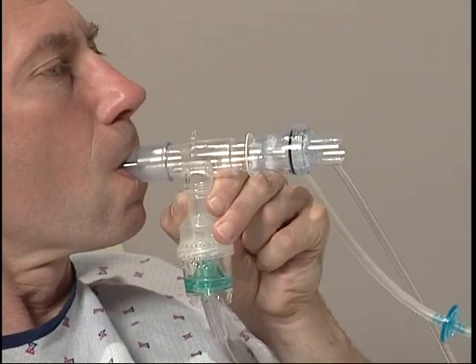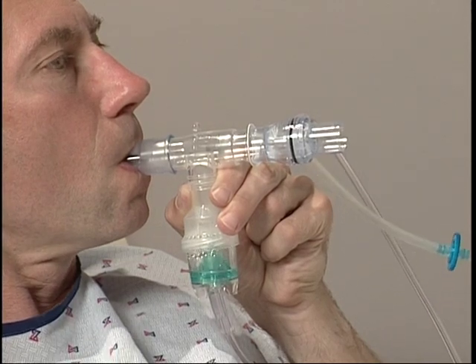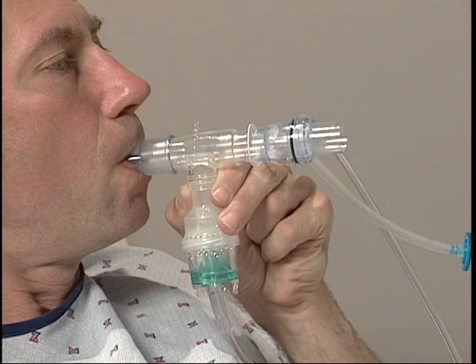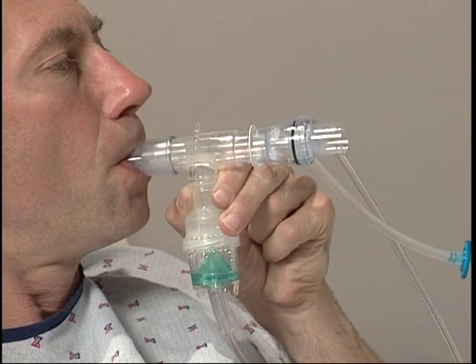Studies also show improvement in peak expiratory flow rate when aerosol therapy is delivered in conjunction with PEP therapy. It's important that the device instructions for EZ-PAP as well as the intended nebulizer are fully understood. The selected nebulizer should be used according to the manufacturer's instructions for use in a positive pressure system.